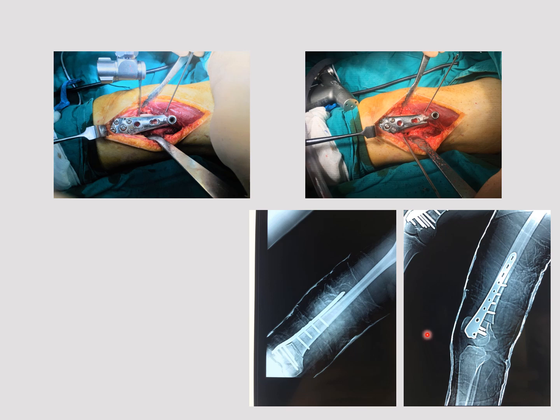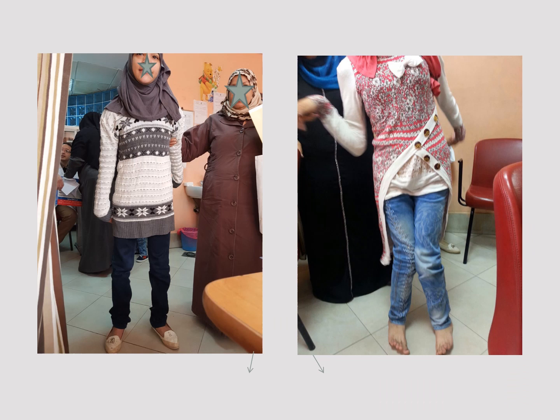This shows the plate being applied intraoperatively — the distal screws have been completely applied, the saw is still in place as the osteotomy has not yet been completed. We then finish the osteotomy, rotate the femur, check that the plate lies nicely on the femoral shaft, and complete fixation proximally. This is the girl after bilateral correction, showing nice alignment of both lower limbs compared to the condition before.